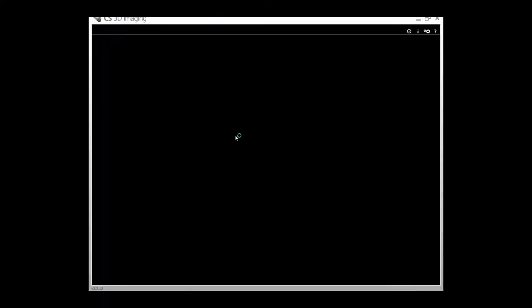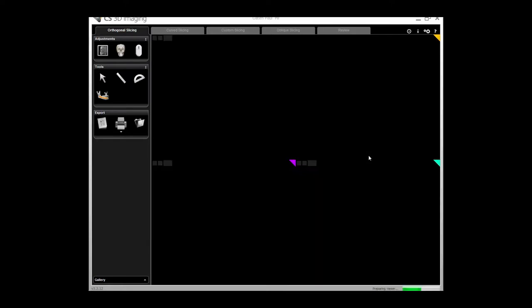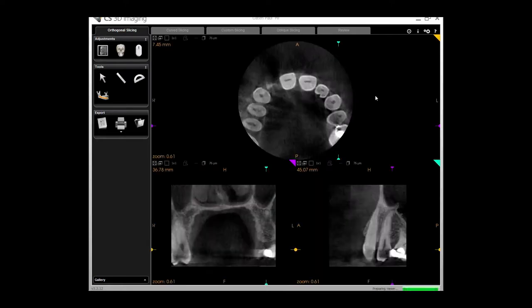Generally I open a volume, but if you open the viewing software it will give you the opportunity to have the viewing software on your computer which may run faster. This will then open up the classic CareStream reporting window in CS Imaging, which sometimes takes a few minutes as the scans are quite large. The window will open immediately onto a tab in the top left called orthogonal slicing, which is the equivalent to MPR.